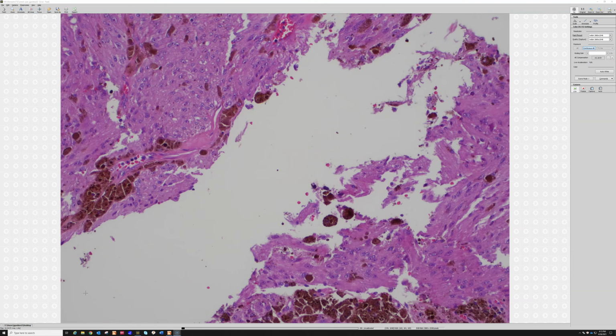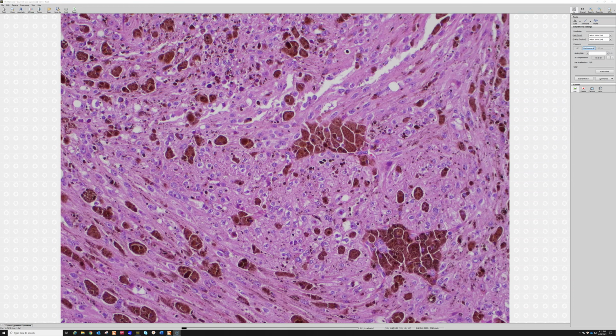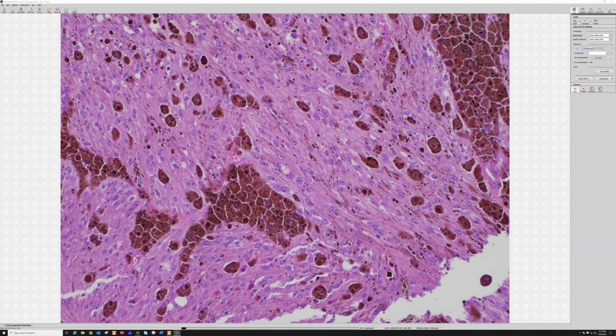And in the past, we really didn't have too much to do because if you stain these tumors, they stain like melanoma. They stain with S100 protein and SOX10, and usually with a variety of melanocytic markers, including HMB45 and MART1 or melan-A, whichever name you like. So those things are not going to really solve the problem for you. It's a tumor that's making melanin and stains like melanoma.